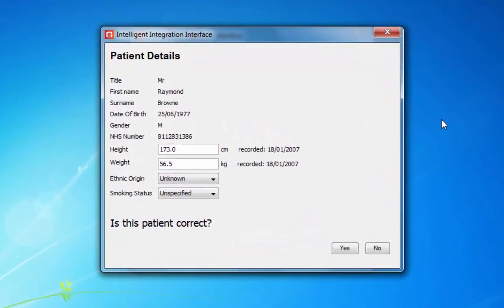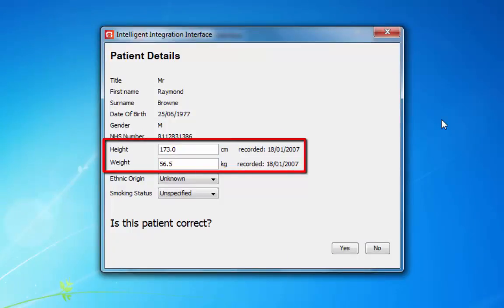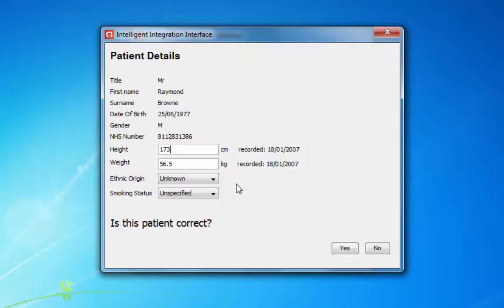If the patient's height and weight have previously been recorded in the clinical system, these will also be shown, along with the date the measurements were last taken. If the values are out of date or not shown, these should be updated now. The ethnicity and smoking status should also be checked and updated if necessary.